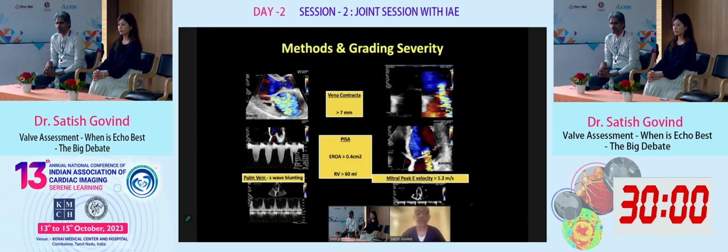And in terms of severity, there are a lot of parameters, but the ones which are frequently used are these, which you see now and then. So the vena contracta, PISA is much talked about, but still used in a limited way. And the other parameters all have limitations. So sometimes there are situations where we are not very sure, and it can be a challenge.